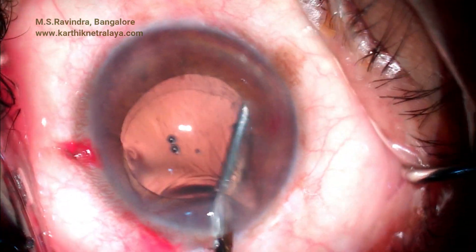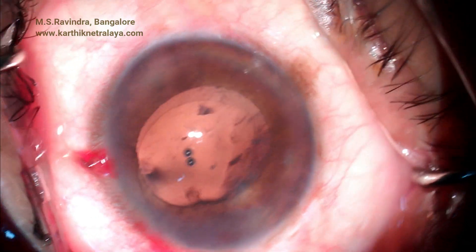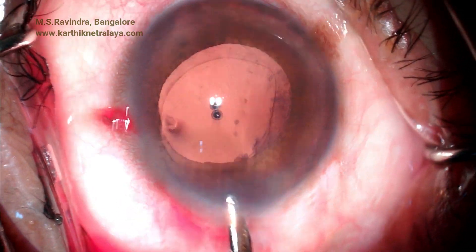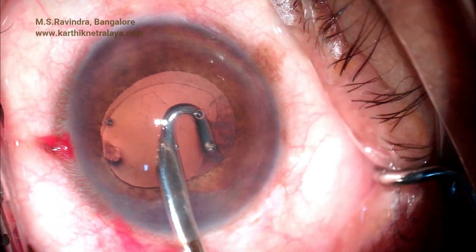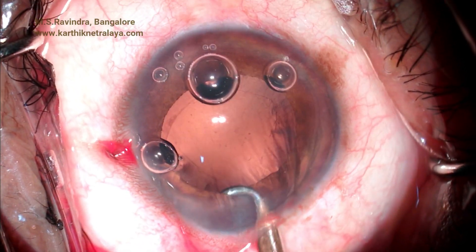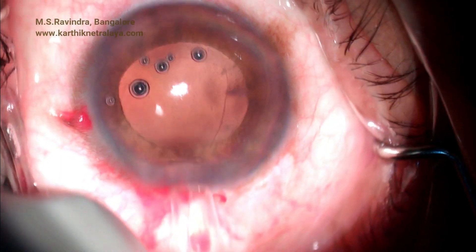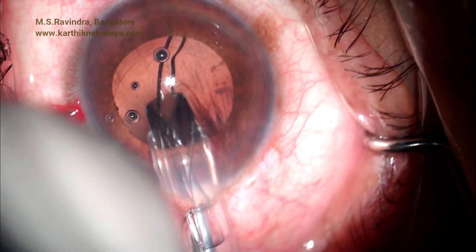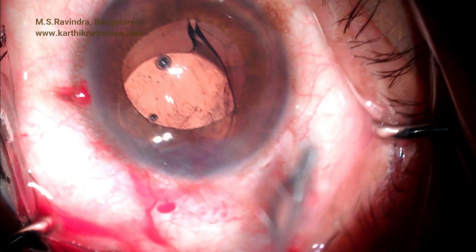The Simcoe cannula is taken up to the equator of the capsular bag, and as there is no side port, the cortex hidden under the incision is aspirated using J-shaped right and left Simcoe cannulas. Viscoelastic is injected repeatedly into the anterior chamber just to deepen the chamber and not to pressurize the eye. The intraocular lens is injected through a split cartridge, which is split on the top to facilitate insertion, and viscoelastic is aspirated at the end of surgery.